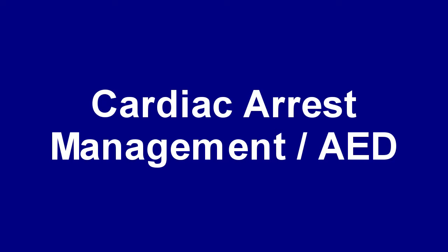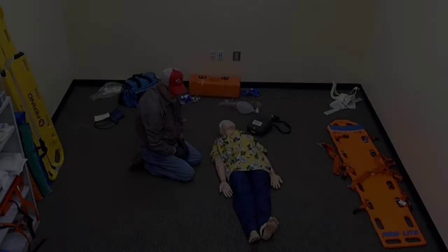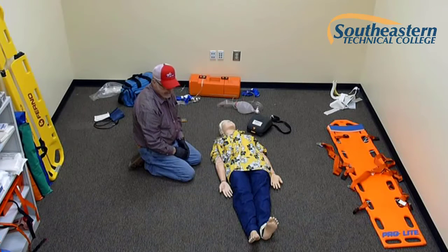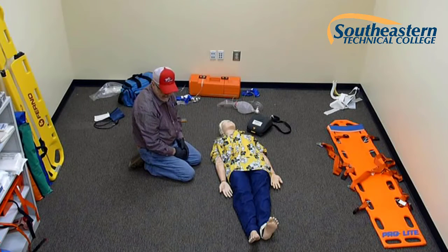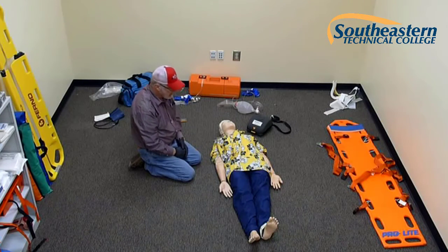You respond to a call and find this patient lying on the floor. As you just heard, in this scenario, you will be required to perform 2 minutes of CPR as well as attach an AED and use it according to your patient's needs. You will have some help that will be able to bring the AED if it's called for. This will not happen until later into the scenario.